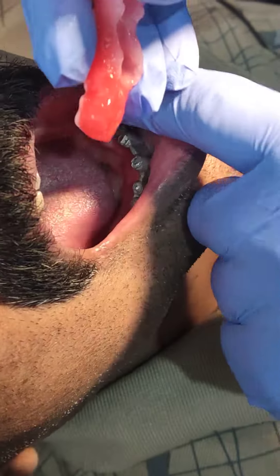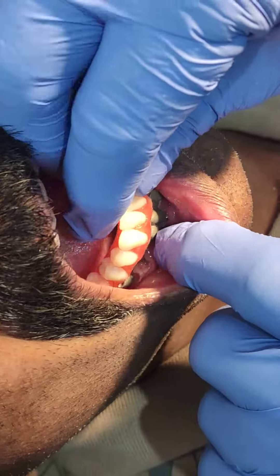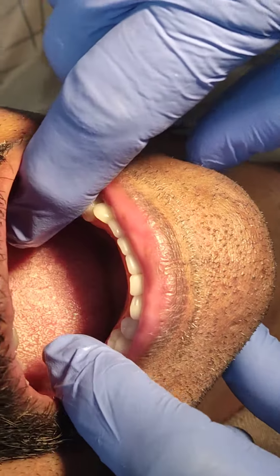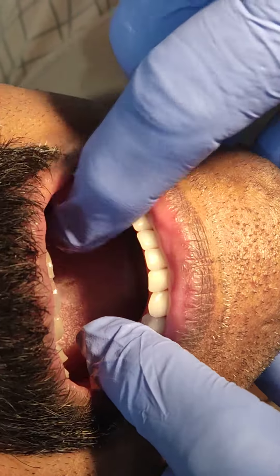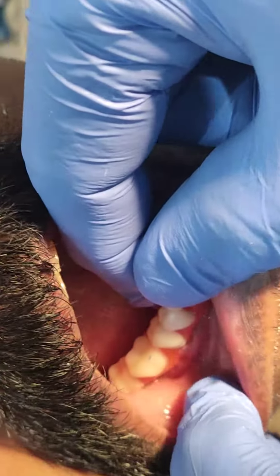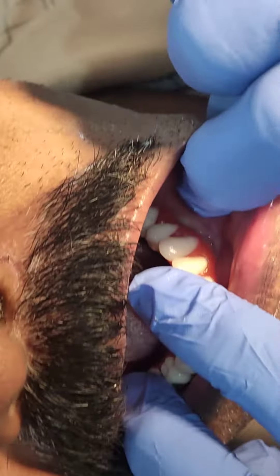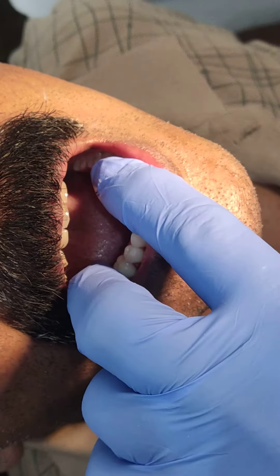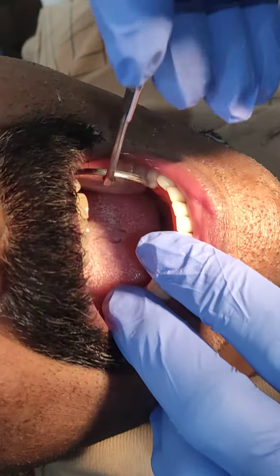This is the trial insertion of the implant-supported hybrid denture, so it's properly fitted all over. You can check here — the visibility is there — you can see the fitting here as well.